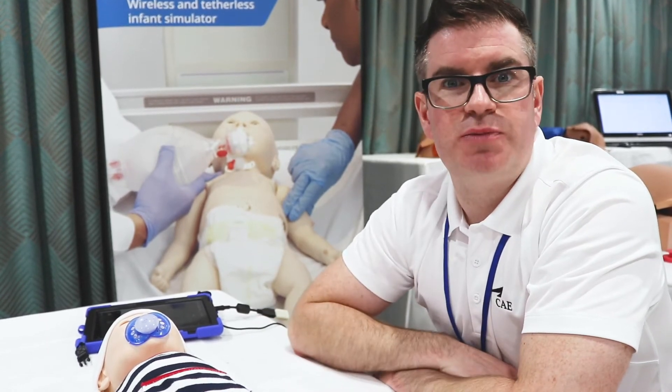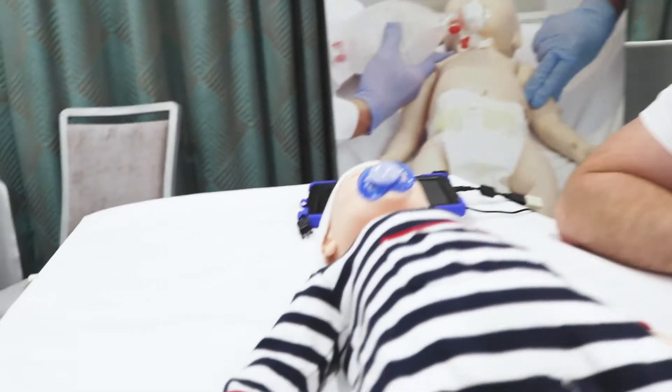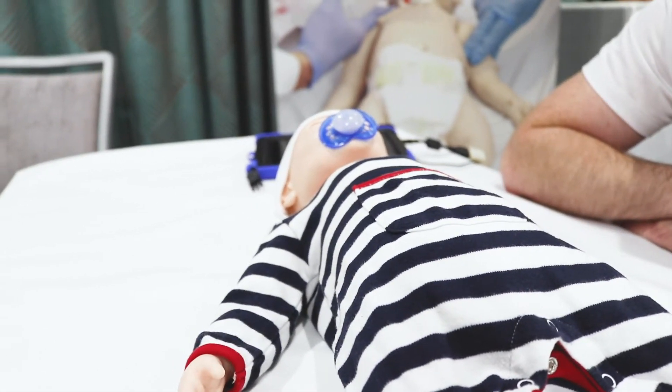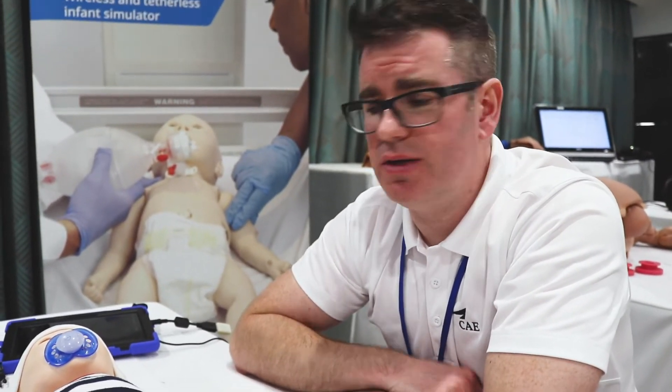Luna has spontaneous breathing — she breathes and we can change her breathing patterns. We can simulate respiratory distress and put some retractions in. We can also shut Luna's lungs down, perform a needle decompression, or put a chest drain in place.